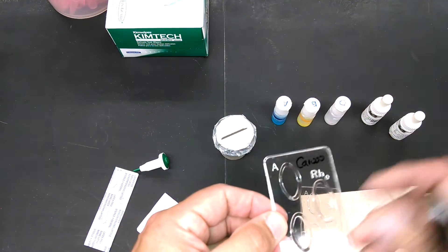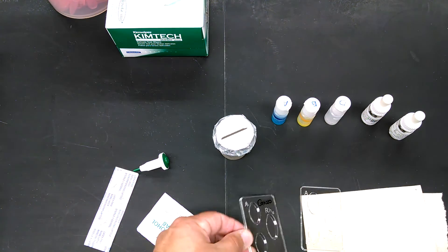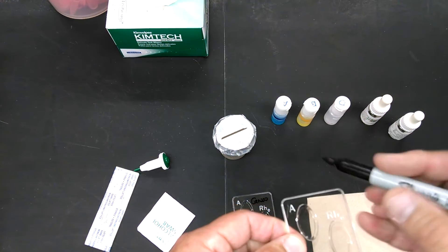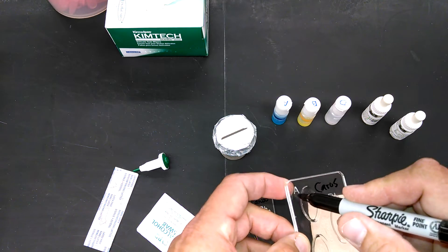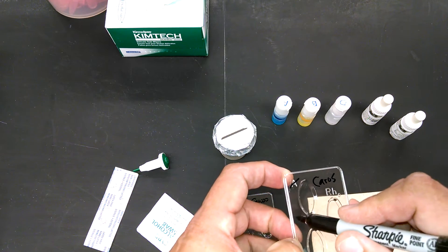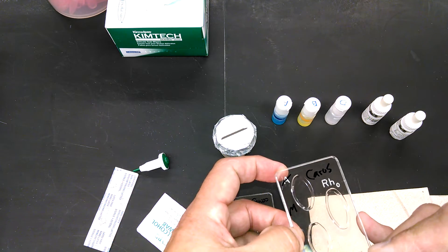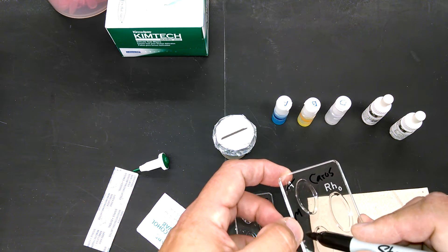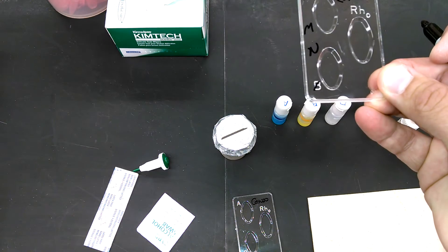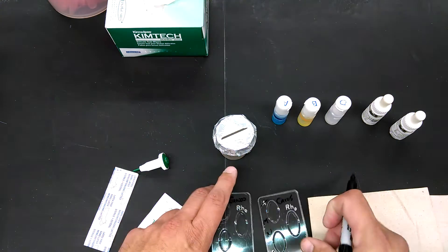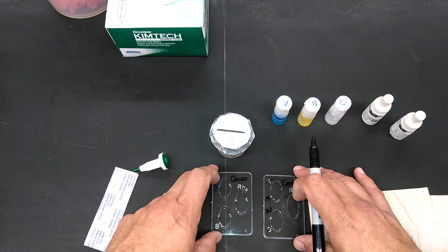Put your name on there, and then you've got your A, B, and RH. On the other one, again, your name, and then change one of them from A to M, and from B to N. So this is now MN. We've got our trays ready.